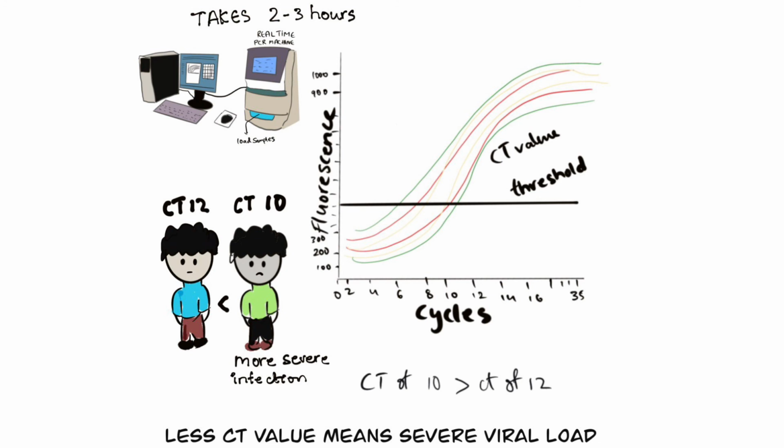So there are many conditions that have to be taken care of to confirm that the person is 100% COVID negative or positive. Some of them are that the results may get affected by the storage conditions and the transportation of your sample to the labs, and the techniques or methods that the personnel use in performing the PCR, or there can be many other conditions. So it's better to be careful because you cannot trust the results 100% always.